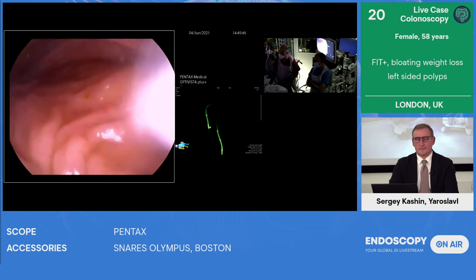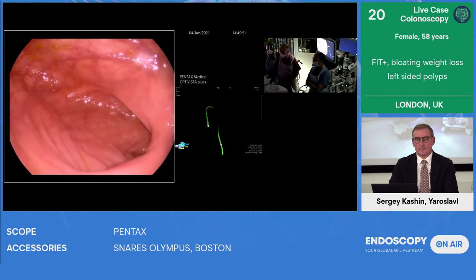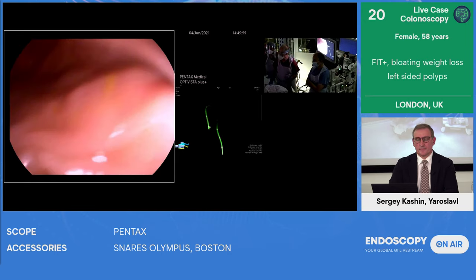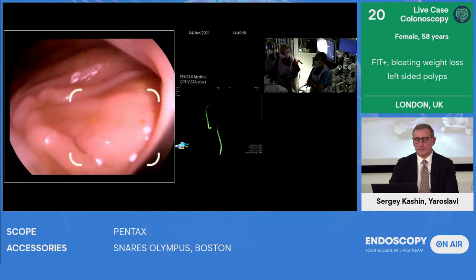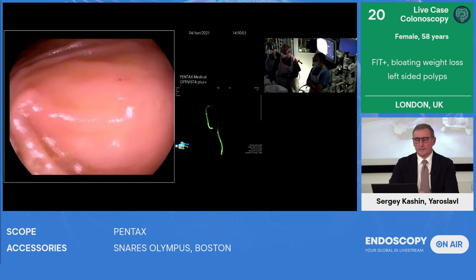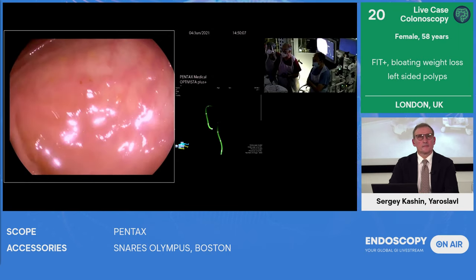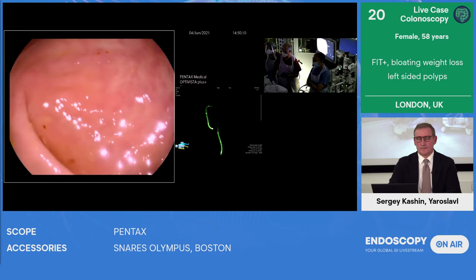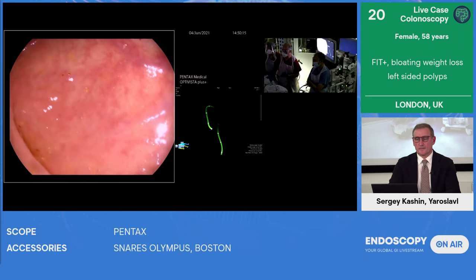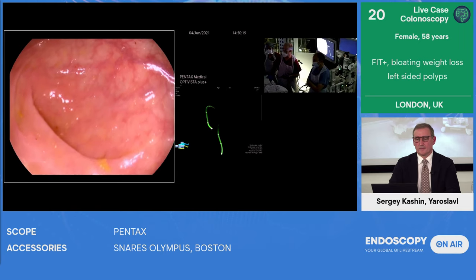When you get to the cecum, the first thing is always just to assess the cecal landmarks. And you can see the ileocecal valve fold bottom right. We just go in a little bit and put some gas in. You can start to see the appendix orifice in the corner. Here, we can't use a cuff or a cap because of the slightly fixed diverticular disease. And I think nowadays for more routine procedures, a cuff or a cap is preferable. But you can clearly see the appendix orifice there.